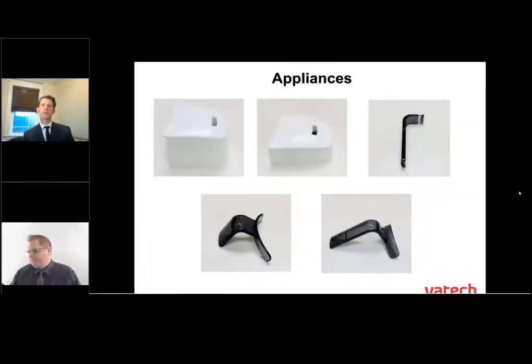Paul, let's go through some of our appliances specifically to the CT device. And I get this question a lot: what do we use for patient positioning on CT? And I always say this is really up to the office or the clinical need. So most of the time you're going to be using your tall chin rests. The questions are, do we want the patient with their arches open a little bit, thus biting on the bite stick to separate the occlusion, or do we want them gently closing on their back teeth? We're going to use our chin cup.